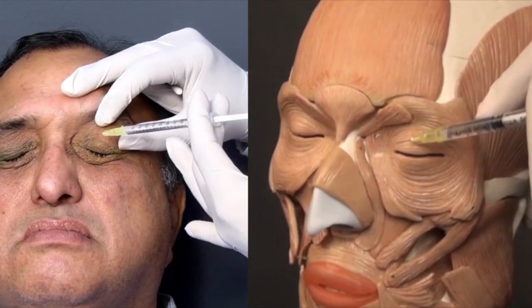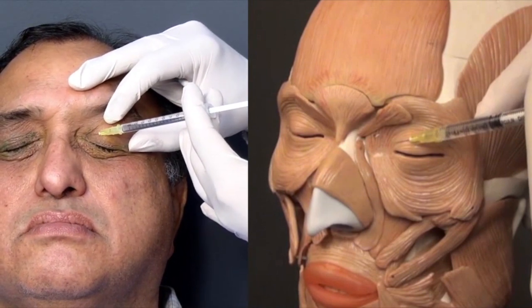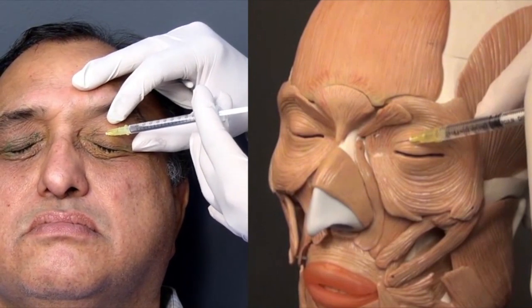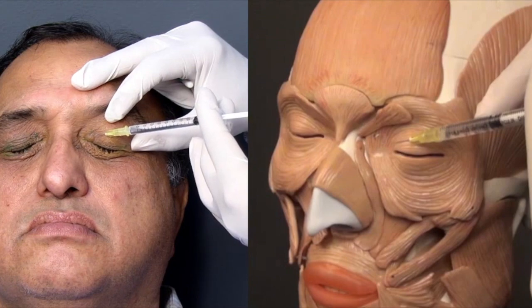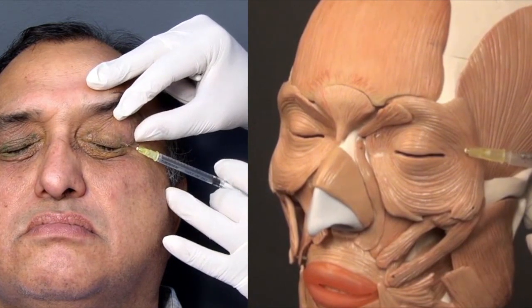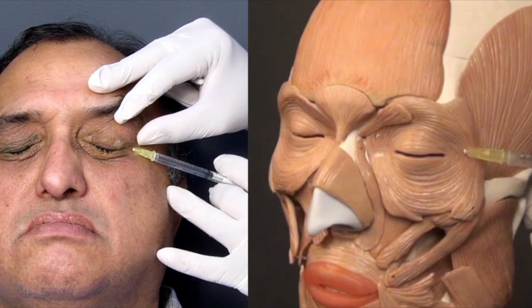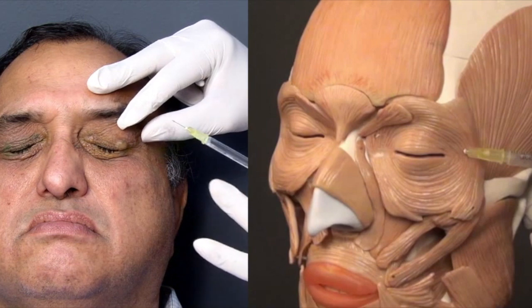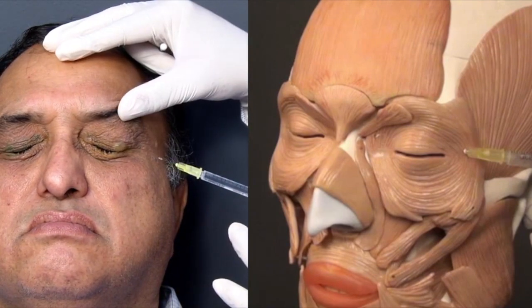I am going to start with the upper eyelid medial injection, which is pretarsal. We had already applied topical anesthetic in that area for the last 30 to 45 minutes. I just go under the skin, lift the edge, and inject 0.1 ml in that area. When I come laterally, I just go under the skin, lift it up, and inject. Though these injections are supposed to act on the muscle, it is not necessary to poke the muscle to inject.